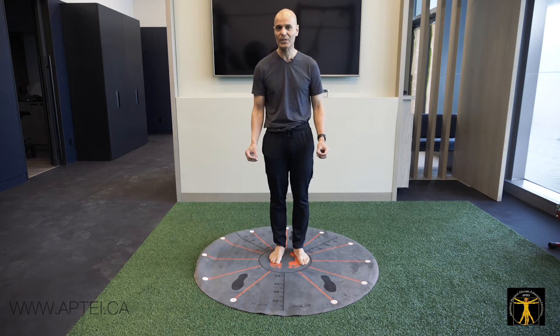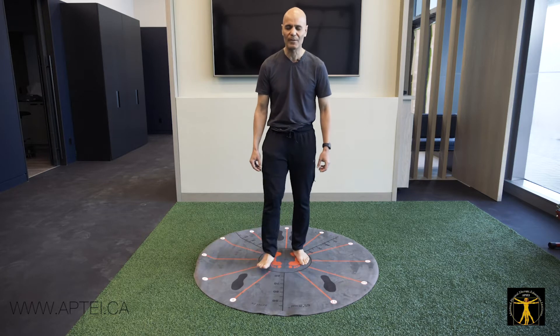I generally do every exercise once with eyes open and once with eyes closed, in the same direction.